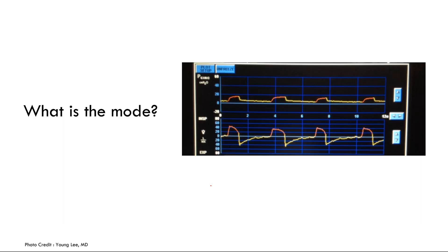What mode do we have here? Pause the video. This one's a bit more difficult. The flow scalar shows what appears to be a dependent variable — not something preset — so the target variable is pressure. Confirmed because the amplitude of every pressure waveform is exactly the same. Most would jump to think this is pressure control, but it is not.